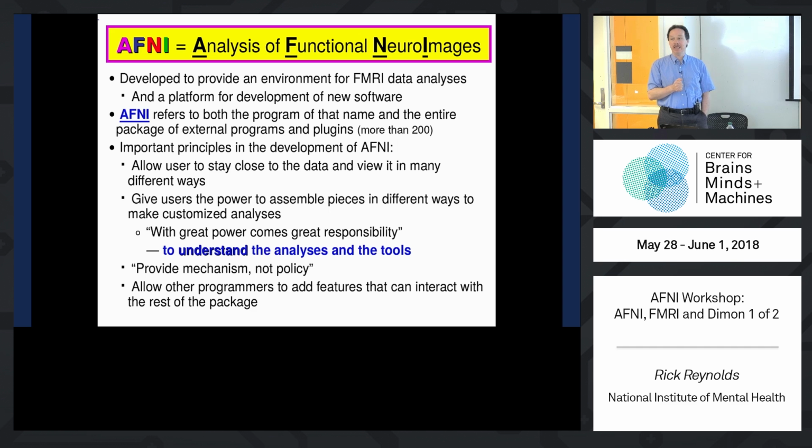So looking at your data is a big part of that. Not only to look for things that seem like they might be anomalies or problems in some way, but also just the more you look at the data, the better you understand what seems like good, or at least typical, data in your environment and what seems like something's wrong.